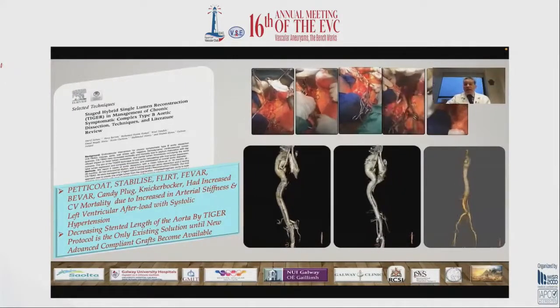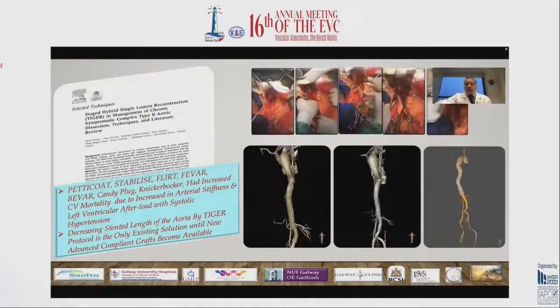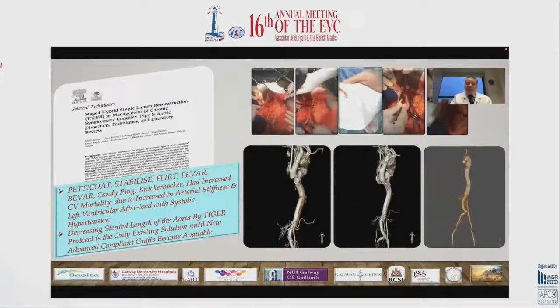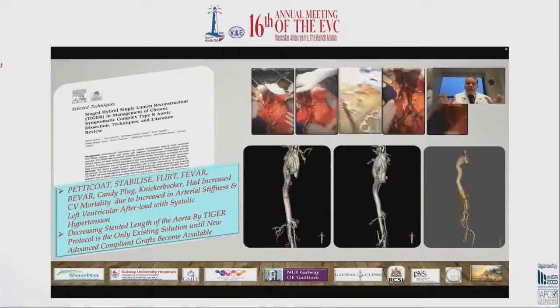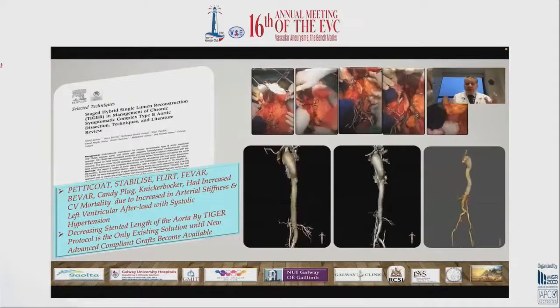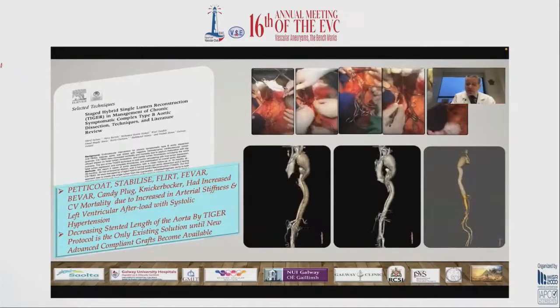So basically, rather than doing a metallic jacket from the arch or ascending down to the common iliac, let's decrease the amount of that huge metallic trash with a lot of polyester in it in order to get a better outcome.